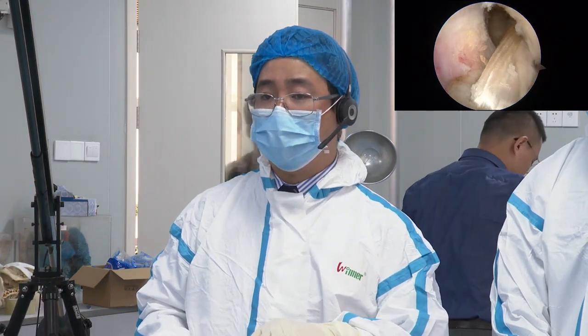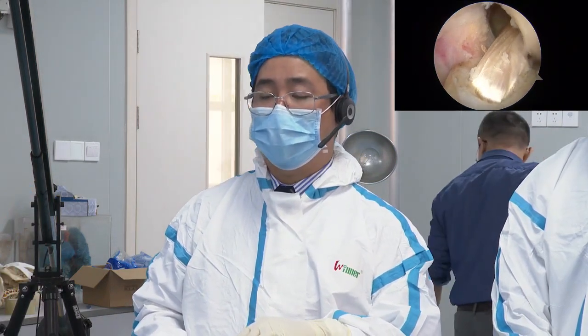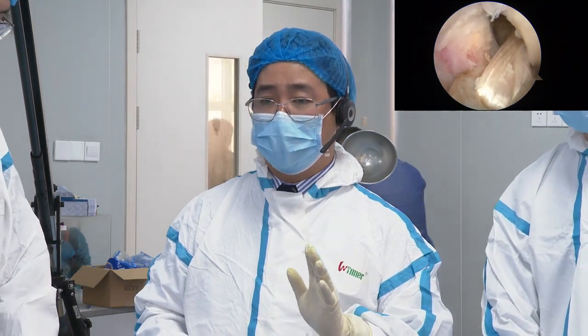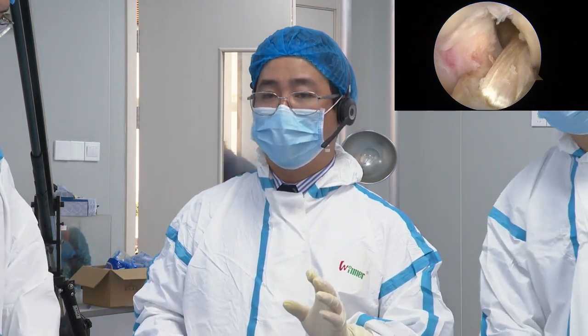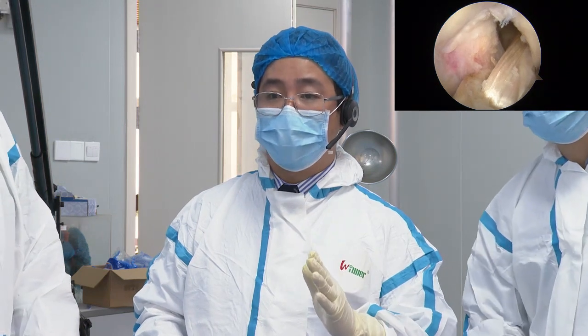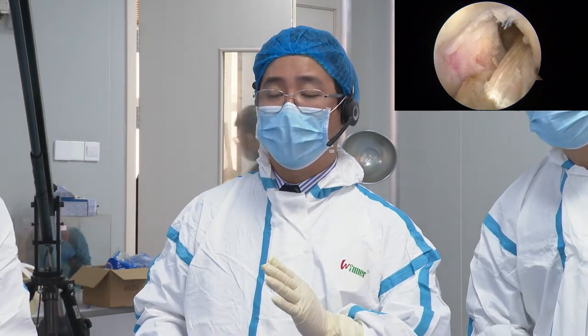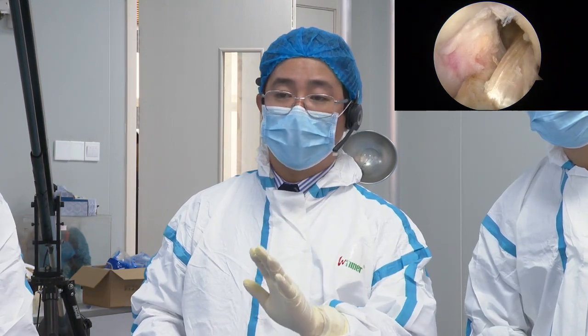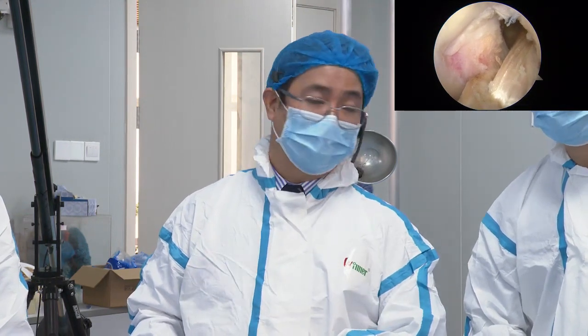Okay, so that is more anatomic, right? That's my idea. Putting the screw in is really important, because the screw size is big. If you put the screw in, the graft cannot stay in the same place. It should be moved somewhere, right? If you put the big screw in the posterolateral, the graft has to move to anteromedial.